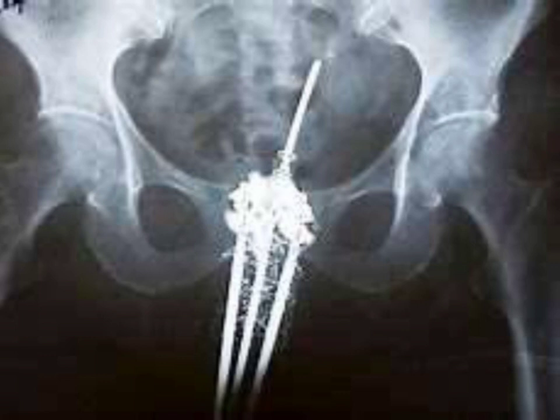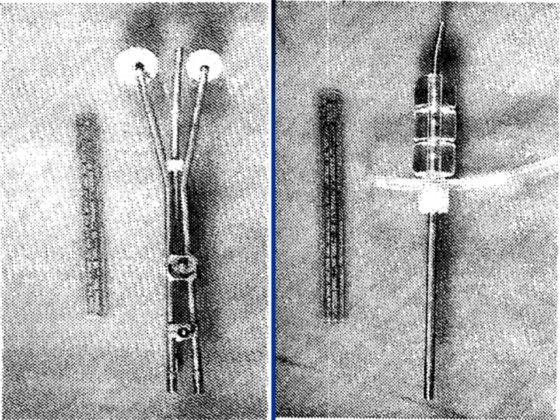You see the check X-ray is done after the applicator is put in place. After the application of the catheters, the central tandem, you see that the tip of the central tandem is bent a little bit in order to protect the bladder and rectum.